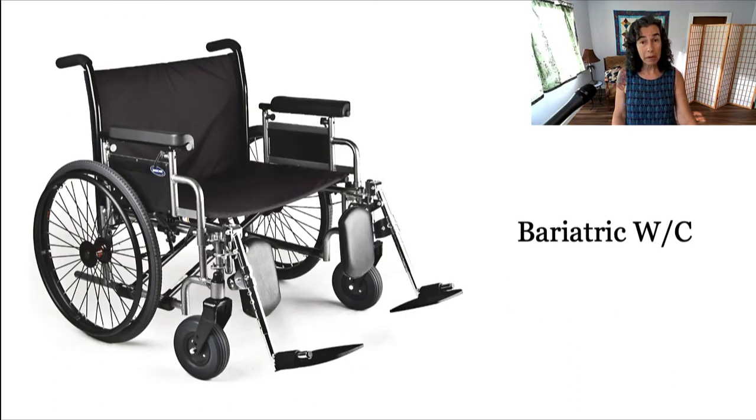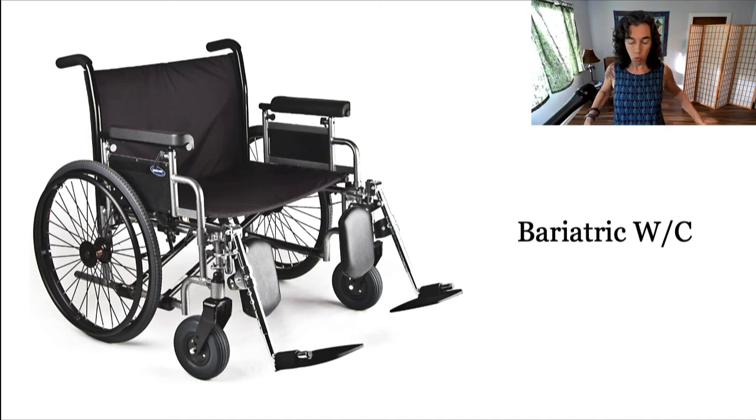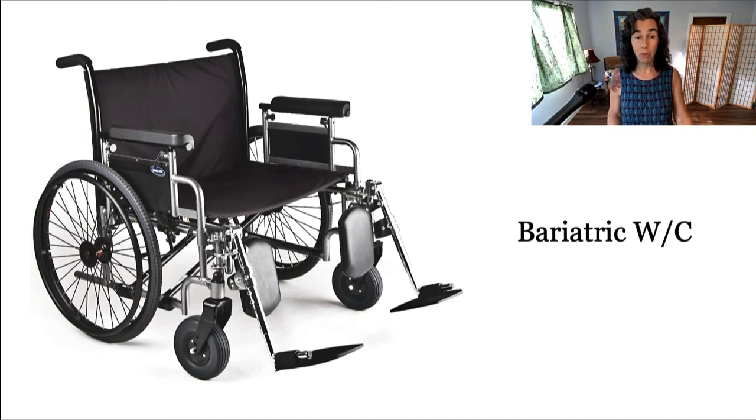There's also bariatric wheelchairs, and those are for very large patients. They start at 20 inches wide. So some folks are going to need a much wider wheelchair depending on their height and weight.